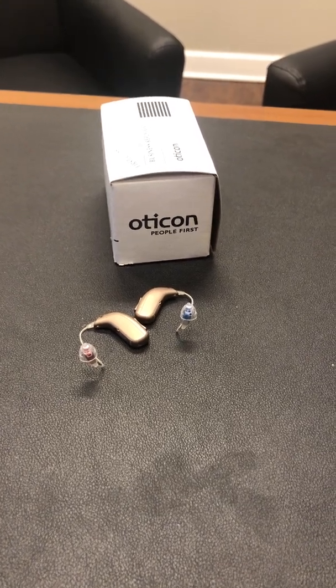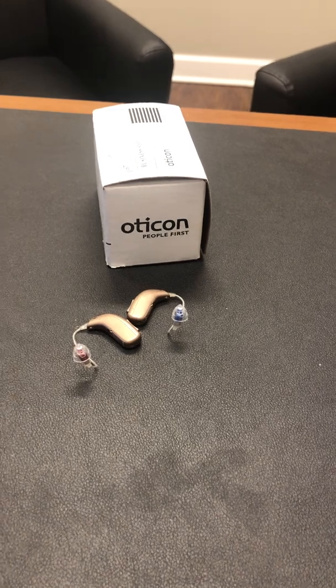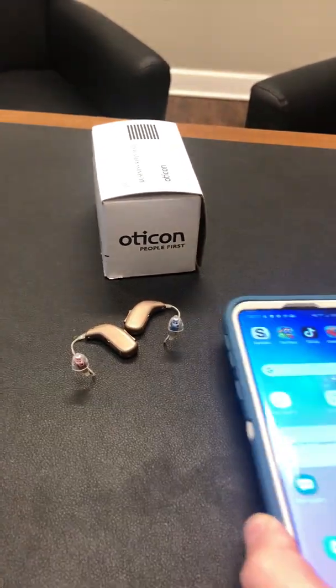Dr. Merrill here in the lab at Coates Hearing Clinic to talk about how you pair your Oticon Open devices to your phone. First we're going to go with the Android cell phone.